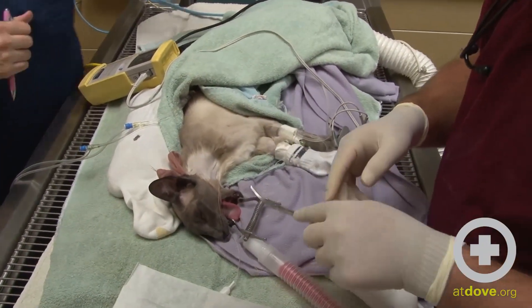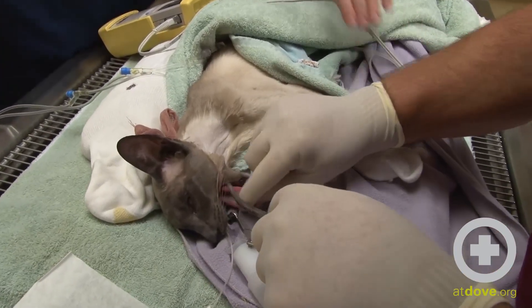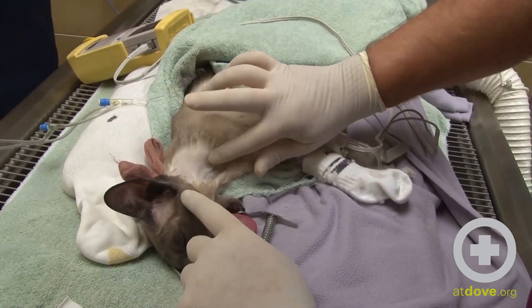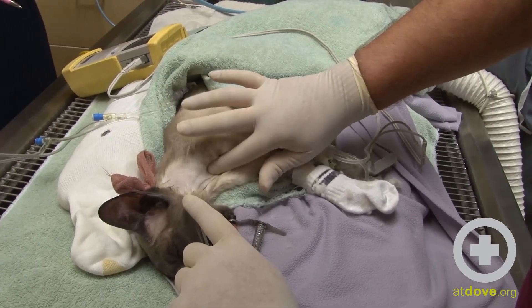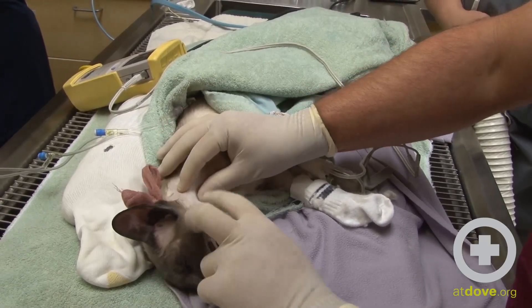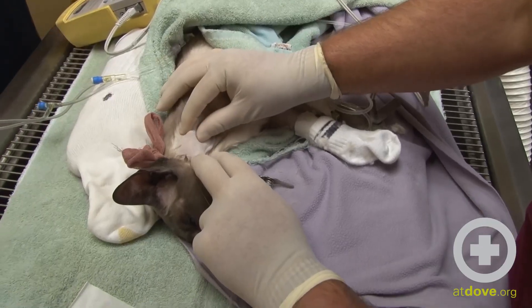We take our carmalt forceps and place them within the oral cavity. We pull the tongue out a little bit and push the tips of the carmalts up. One of the landmarks we want to watch out for is the jugular vein — we don't want to cut into the jugular vein. We flip up the carmalts and position them in the middle portion of the neck.